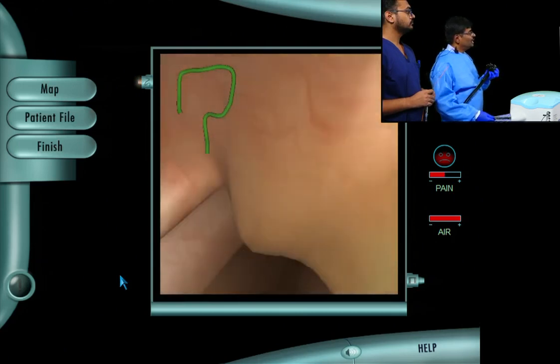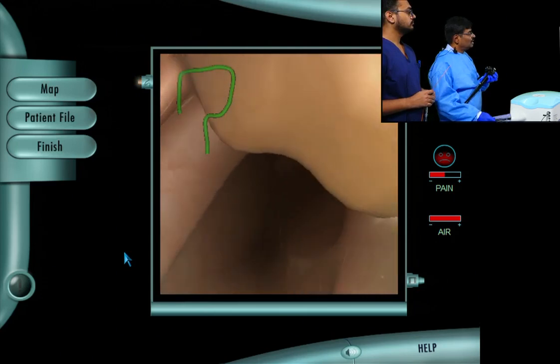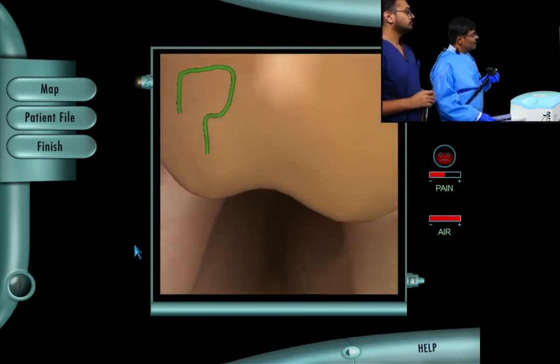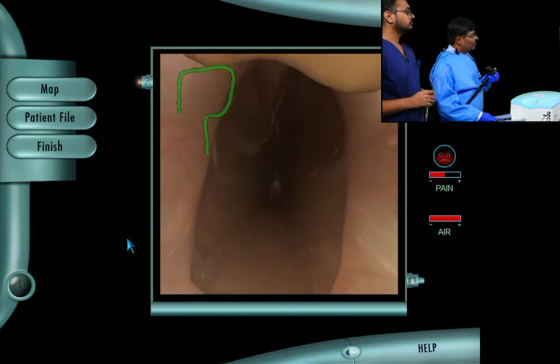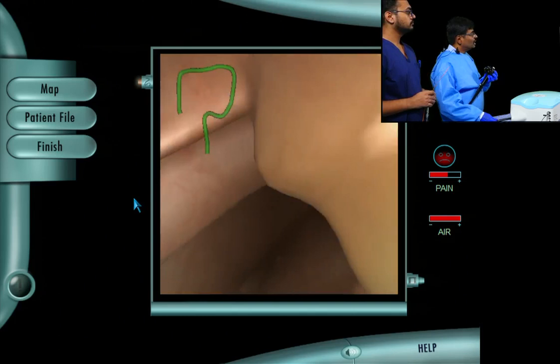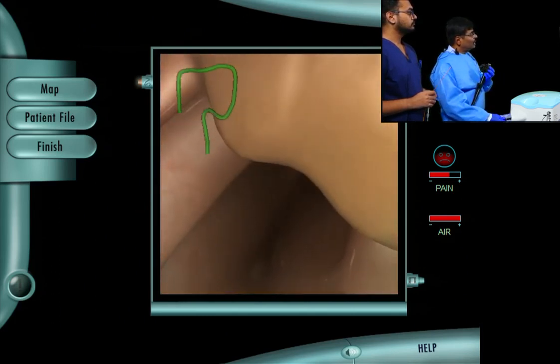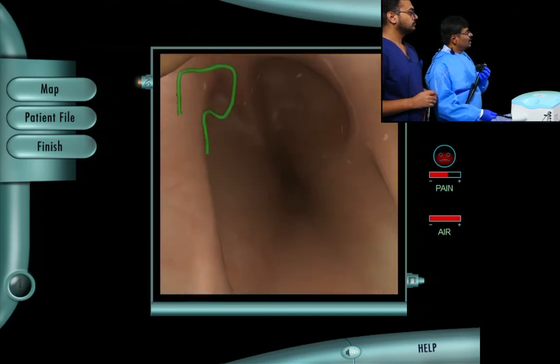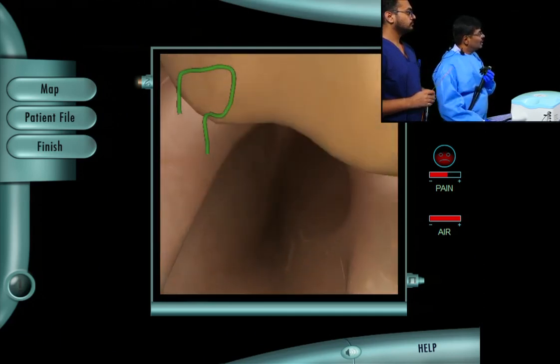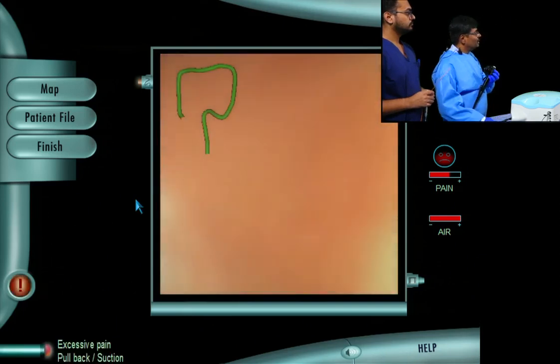Now, what do you see, something like a W, that is actually a depiction in this virtual model of the location of the last haustral fold, that is the ileocecal fold, and the appendicular opening you will be seeing down there, and also the crow's foot. Then right at this area of the ileocecal valve, keep it around 12 o'clock position, reduce the loop, then just enter, you will be able to enter the ileum.